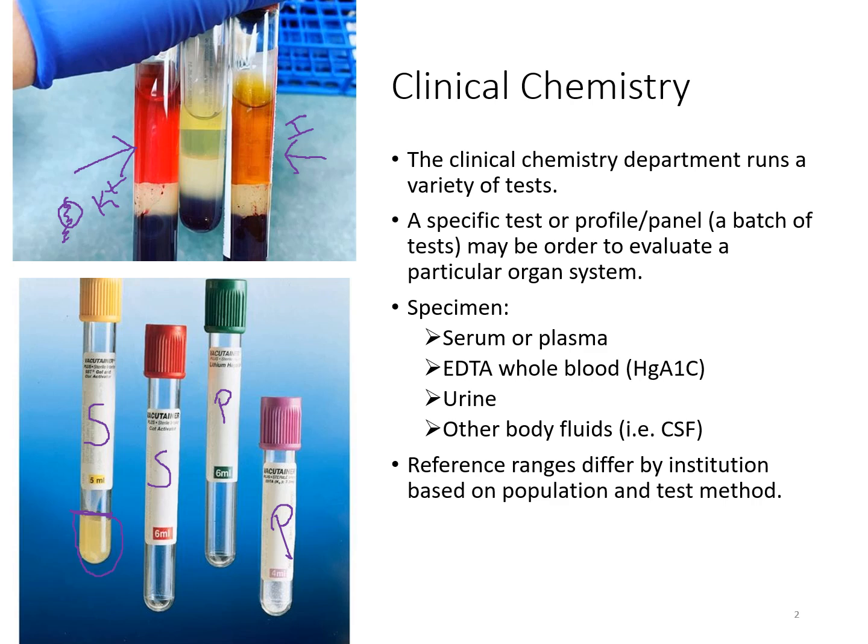Typically most of your tubes will look like the ones here in the center, where you've got just a pale yellow color to the serum or plasma. And this glob of stuff here in the center is your gel. When you spin the tube down, the red cells go to the bottom of the tube, and then you have this gel barrier here in the center, and that gel barrier keeps anything from leaching out of those red blood cells and getting into the plasma and causing any sort of false results.